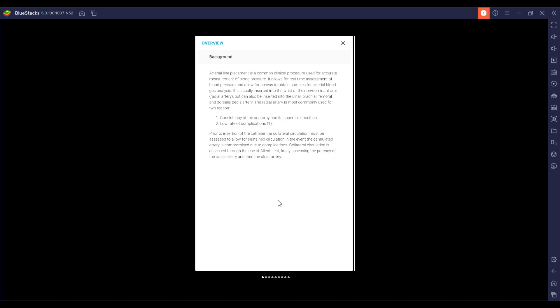The radial artery is most commonly used for two reasons: the consistency of the anatomy in its superficial position and a low rate of complications. Prior to the insertion of the catheter, the collateral circulation must be assessed to allow for sustained circulation in the event the cannulated artery is compromised due to complications. Collateral circulation is assessed through the use of Allen's test, firstly assessing the patency of the radial artery and then the ulnar artery.